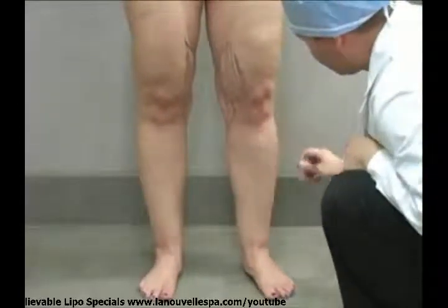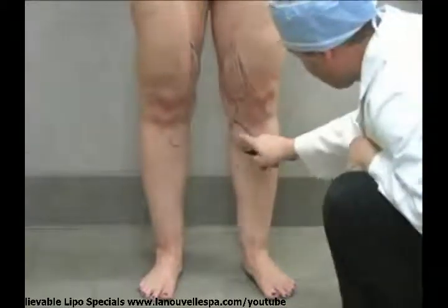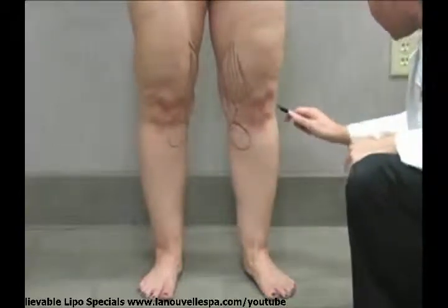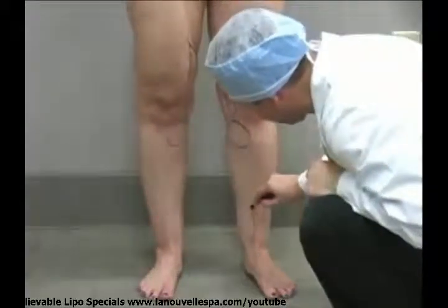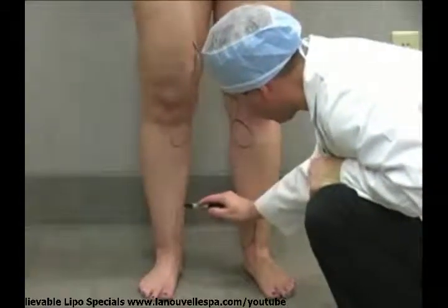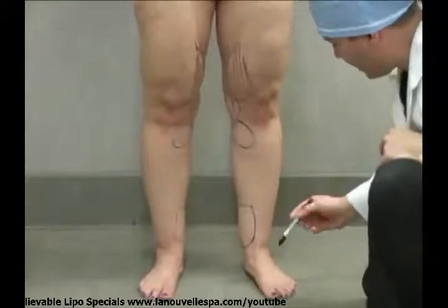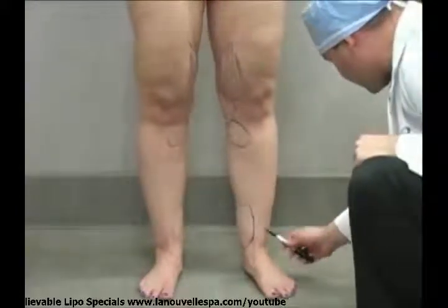When I look at your legs here, there's a couple of things with the calves that give them a slimming effect. One, we'll create a little bit of an indentation there. She also needs to be debulked here a little bit. And then we come down to the ankles, and the ankles are a very important area. We want to be able to better see this bony prominence that gets a little hidden in the fat pad around the ankles. So I'm going to make little incisions right there and there, and the same thing on the outside.